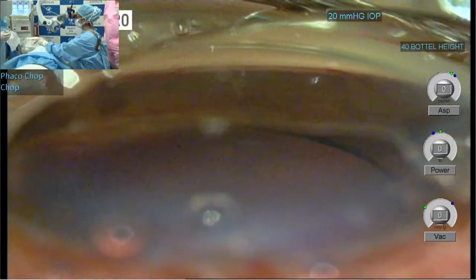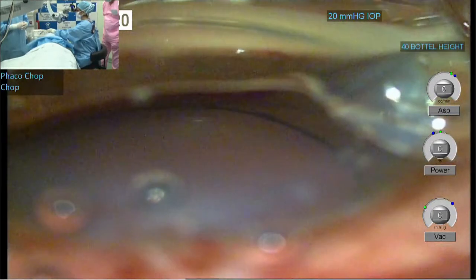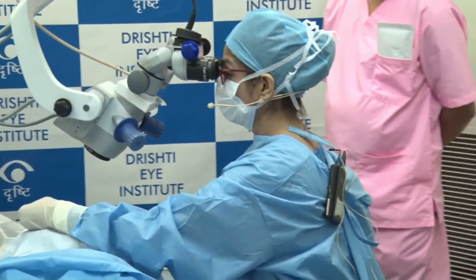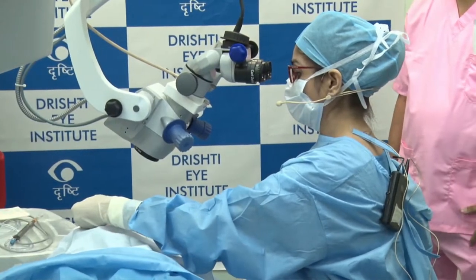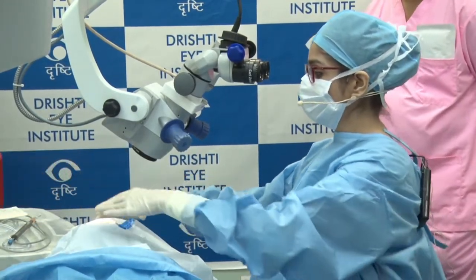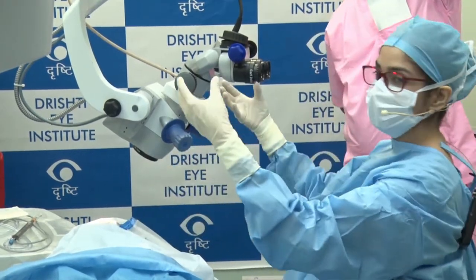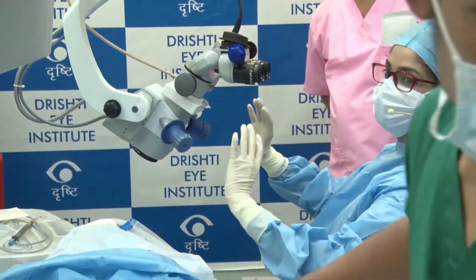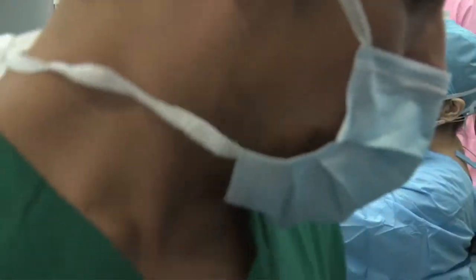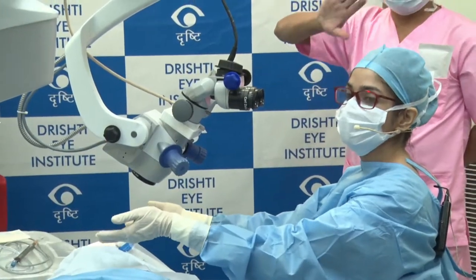Dr. Saiba, another question. I'm Dr. Smriti here. Would you please tell us how you tilt the microscope to see the angle structures? Yes. This is how the patient's head has been tilted 35 to 45 degrees away from me, and the microscope has been tilted 35 degrees towards me. You can see this angulation. This is how the microscope is, and the patient is away from you.